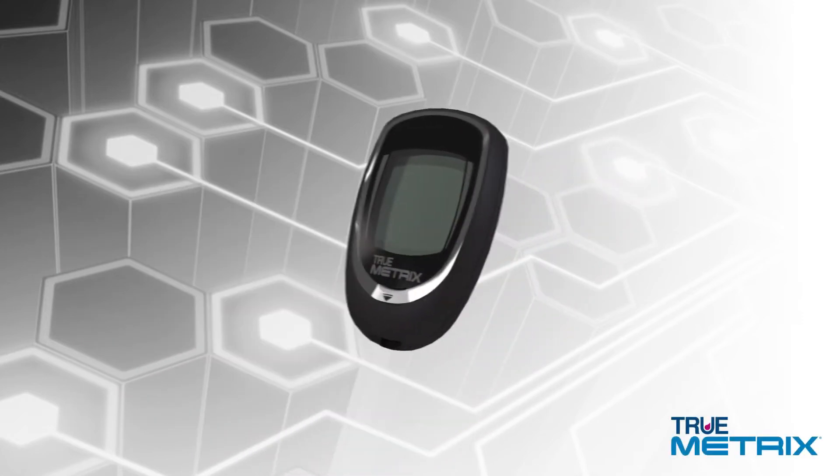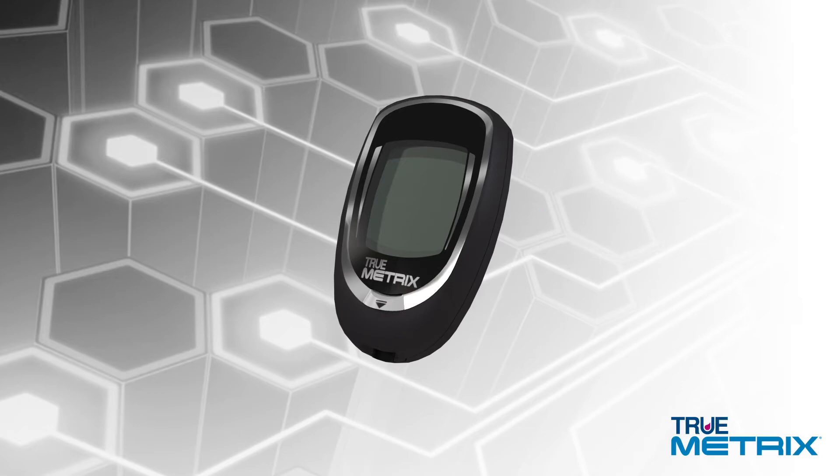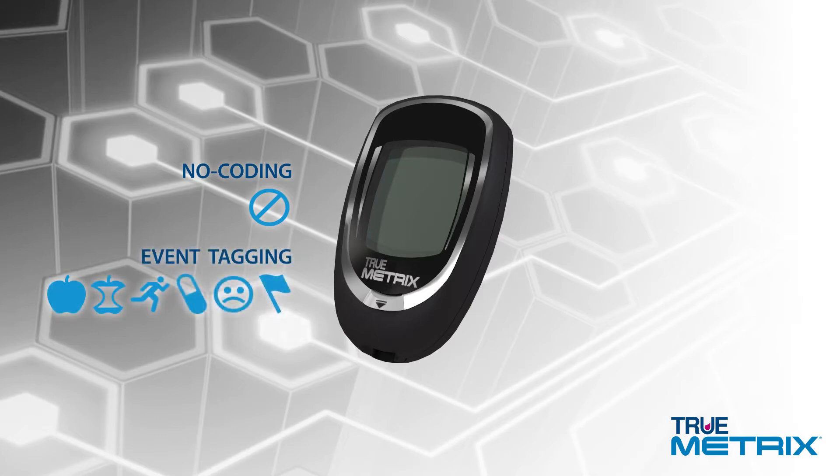Welcome to a new experience with your TrueMetrics blood glucose monitoring system, featuring TripleSense technology. The TrueMetrics blood glucose meter is a no-coding, full-featured system offering easy-to-use glucose testing, including event tagging for more comprehensive glucose tracking, plus testing reminders and alerts.